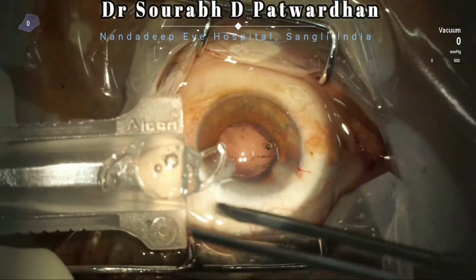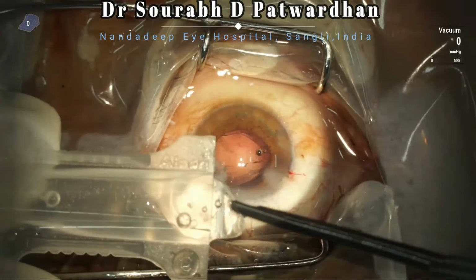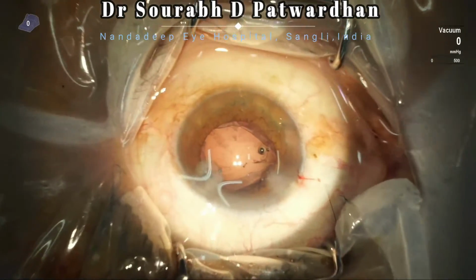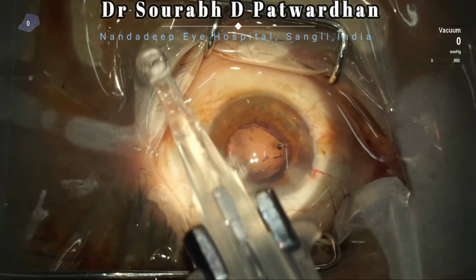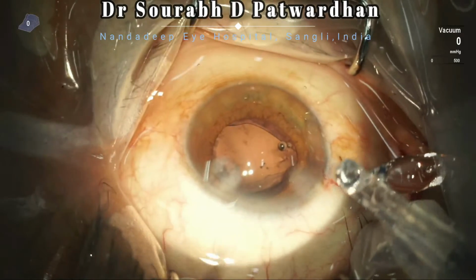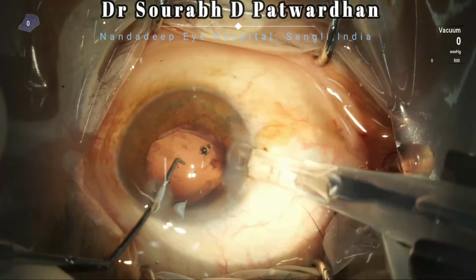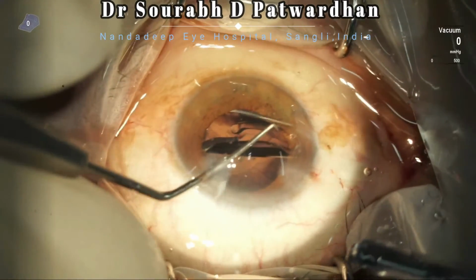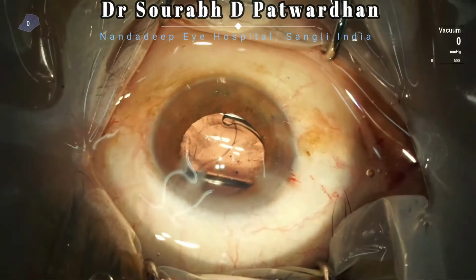Now in this case, because I found that the bag is intact, I can place a single piece IOL. You can always go for a three-piece IOL in case you have doubt, and place it in the sulcus. In this case, the posterior capsule is intact, so I will be placing this IOL in the bag, but perpendicular to the axis of the Argentinian sign, so that it gets good support of the fornices of the bag, because the haptics of this single piece IOL must rest inside the bag and should not come out of the bag at any place.